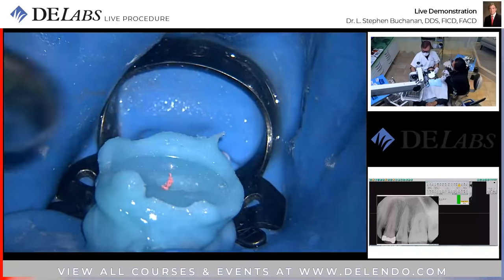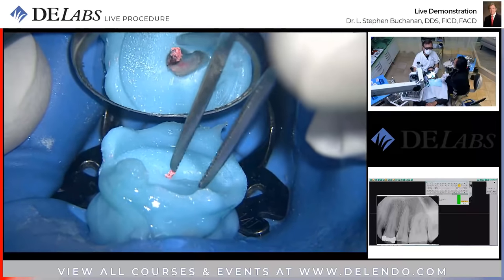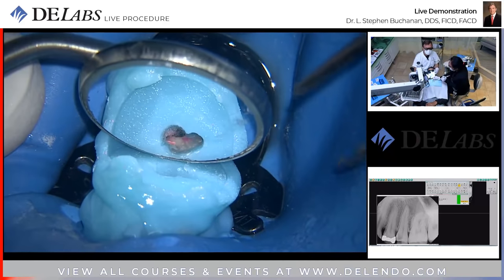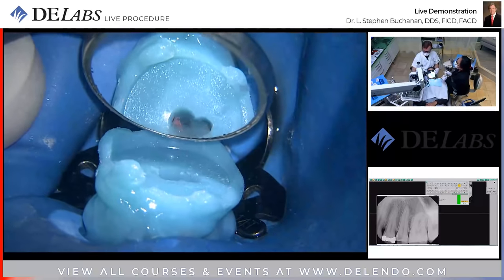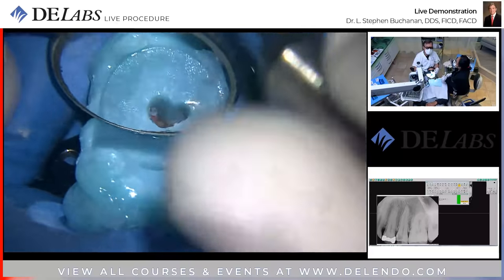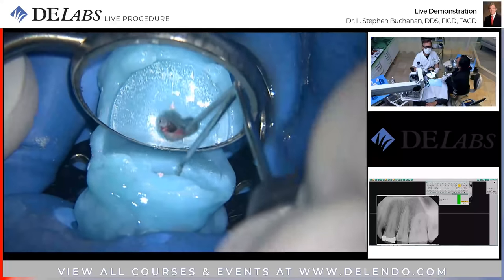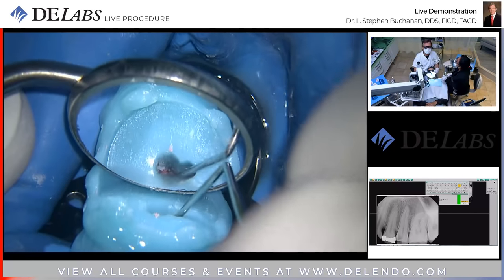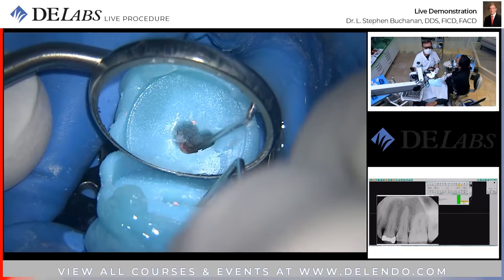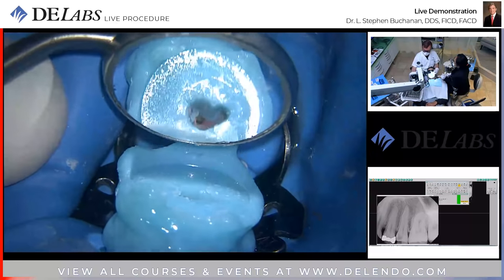Another great tool is Yoshiteru Uchi's file retrieval kit. He has a really cool little gutta percha removal tip. Okay, so there's the first one. All right, let's cut this thing.